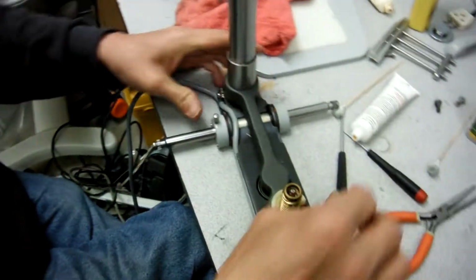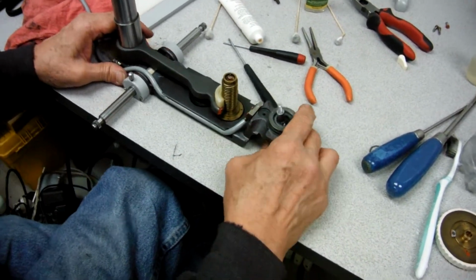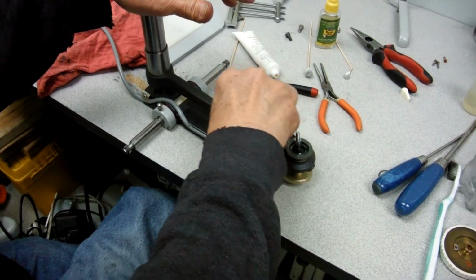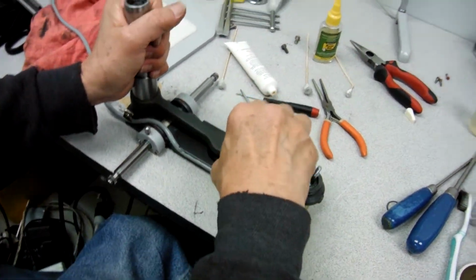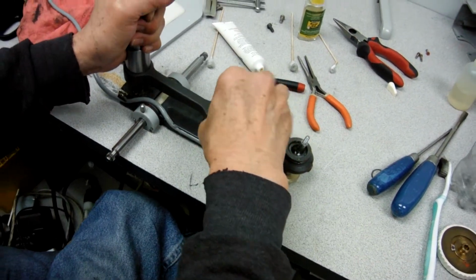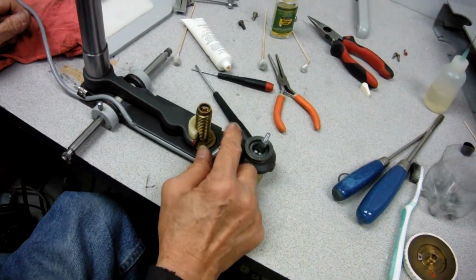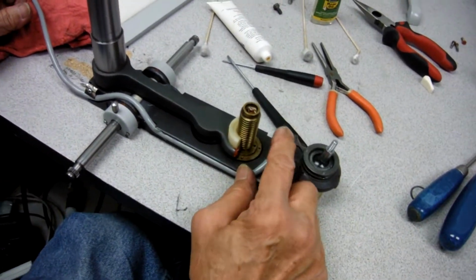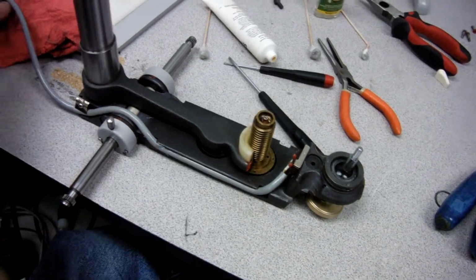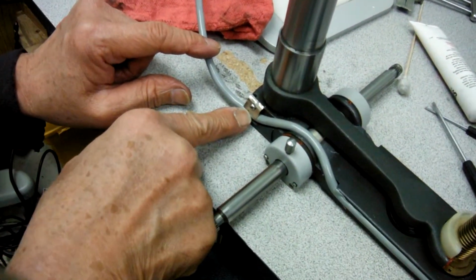Alright, that's done for that one. Now we can put the cover back in place. After you make sure you've got this in there, make sure you move it up and down well, and you feel good about that. If not, you can also take it apart again, clean this, and put it back together again. Like I said, most of the time, if your override switch doesn't work, either the micro switch needs to be replaced or the cord is broken somewhere else. But 99% of the time it's broken right here.